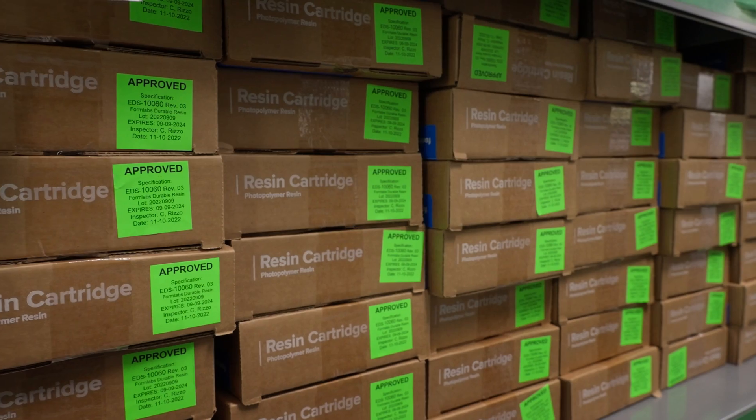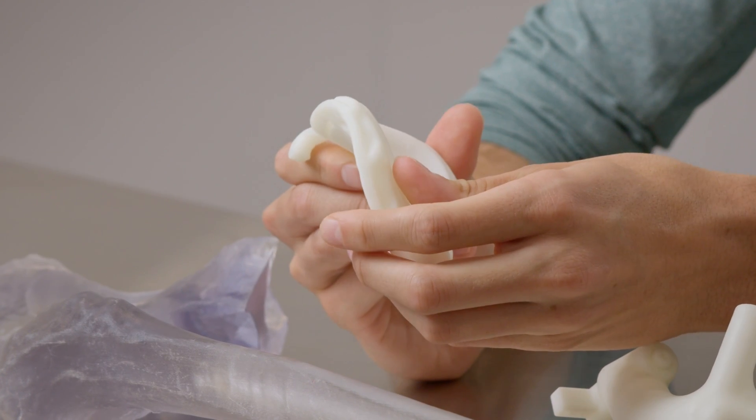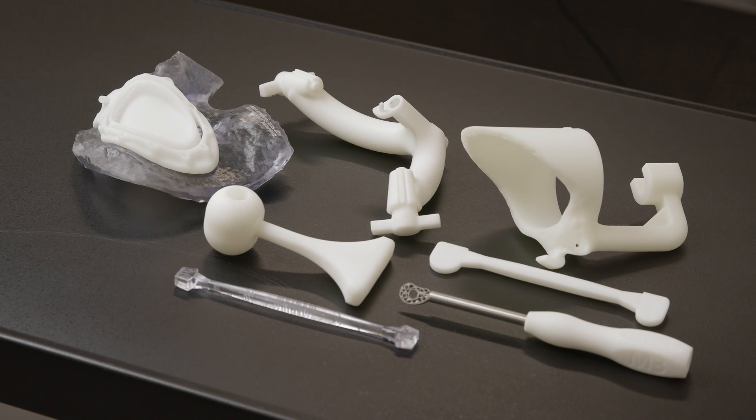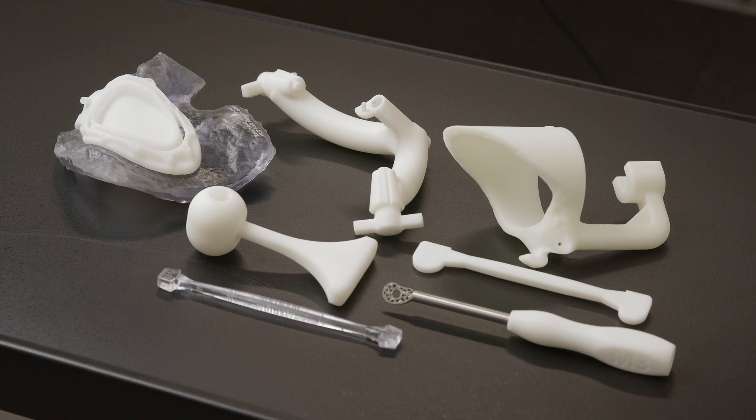The reason that we like Formlabs resin is its intraoperative characteristics. It's tough. It allows us to really print what we want without too much concern about material thinning or breaking. Things like impactors, cutting tools, drilling guides—if we can't provide something in metal, odds are that we're able to provide it in resin and get the function that we need.